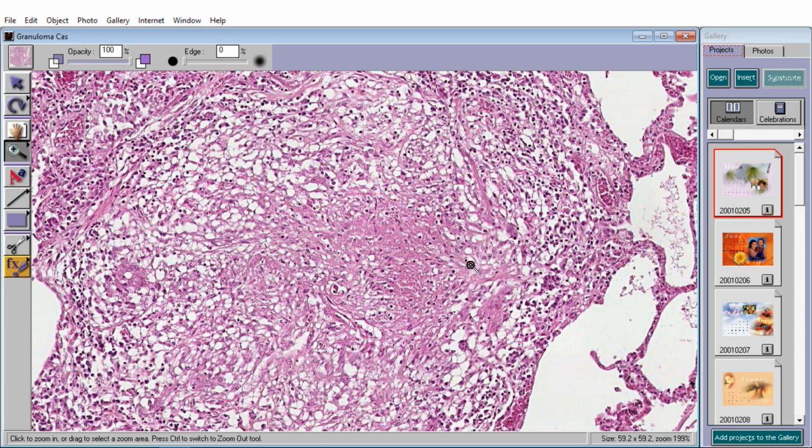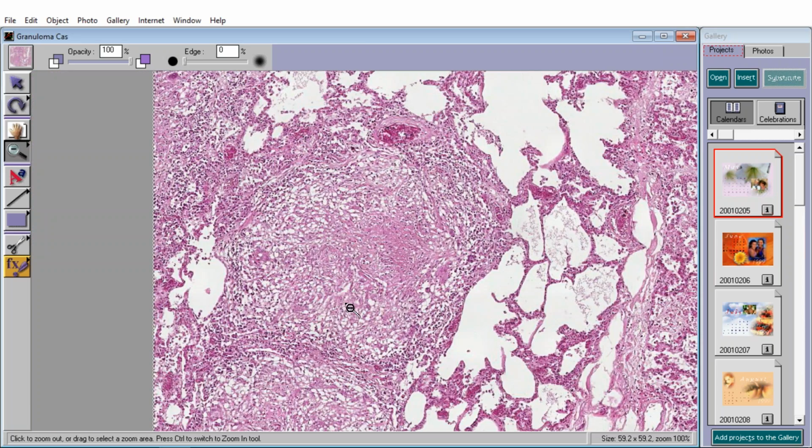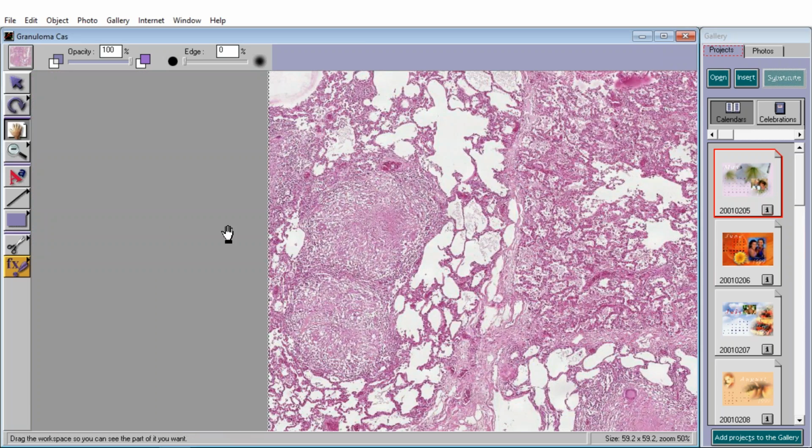Now let me ask you this. In this particular granuloma, would you say that the inside or the center is kind of granular and crunchy and not quite as viable or visible on the outside? And if you don't want to answer that question, let's take a look at the other granuloma that we saw, the one that was bigger, because that's going to be down here.